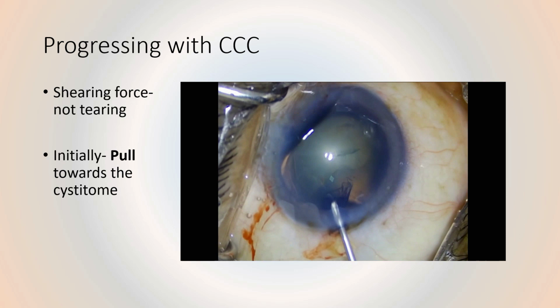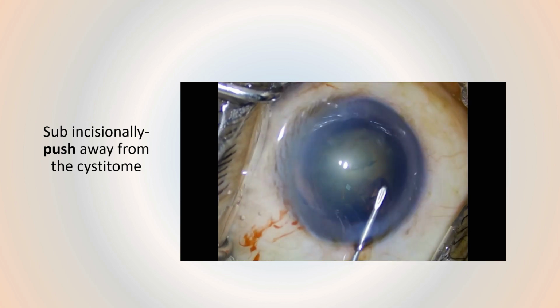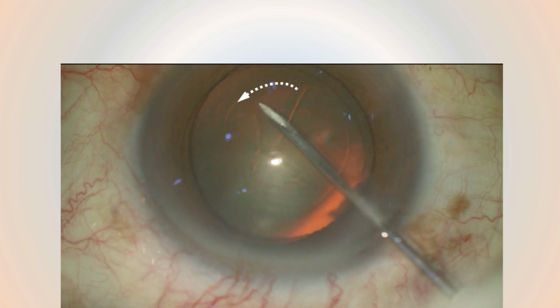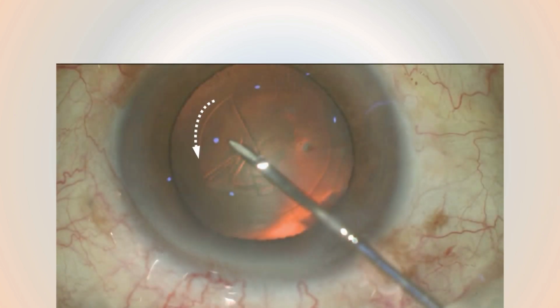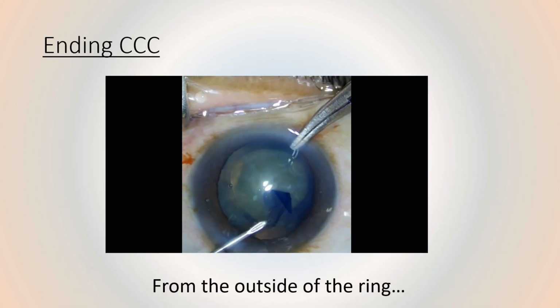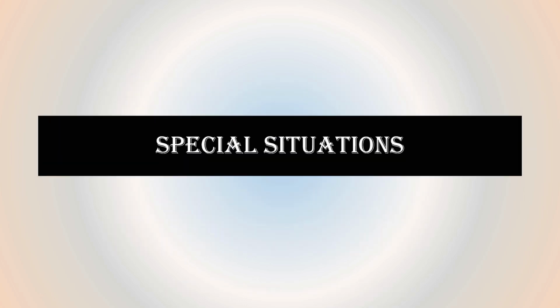Initially, pull towards the cystitome. Subincisionally, once it reaches the subincisional part, push away from the cystitome. When the rhexis flap is folded on itself, the faint line that is visible along the margins gives us a clue as to where the capsulorhexis is going. How do we end it? Always from outside the ring.